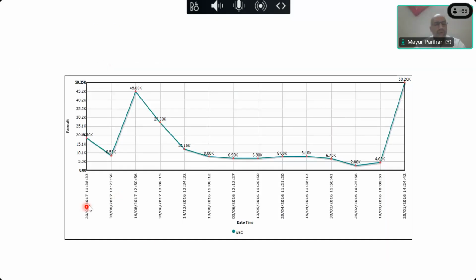Now, what you see here on the graph are the dates, and these are the WBC counts. The treating physician read the report in a wrong way. We said the FISH for BCR-ABL is negative with 3 copies of the BCR gene. He misinterpreted the result as positive and started the patient on imatinib. The moment he started the patient on imatinib, the patient responded very well and the counts came back to normal.